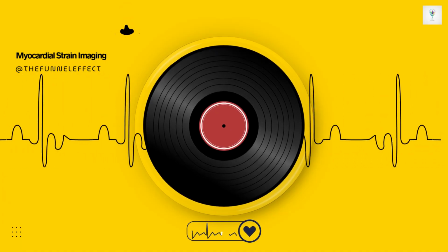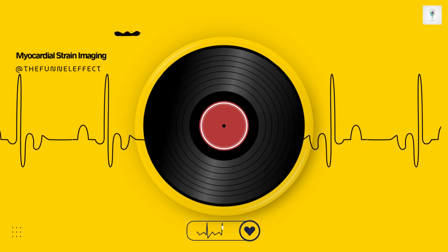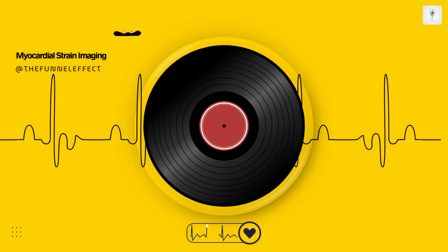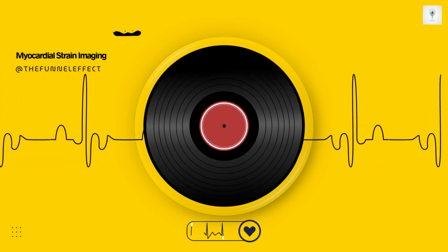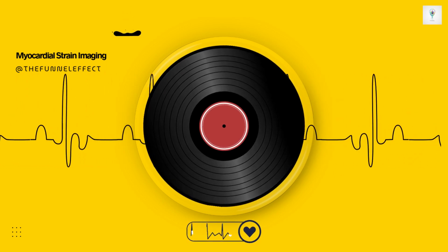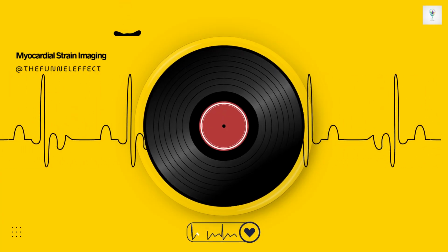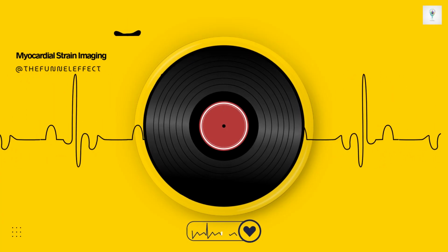How do we estimate LV pressure non-invasively? We typically use the patient's brachial cuff blood pressure as a surrogate, although we might need to make adjustments in specific conditions like severe aortic stenosis where the cuff pressure doesn't perfectly reflect LV pressure. And combining pressure and strain gives us... It allows us to construct a pressure-strain loop for each segment, or globally.